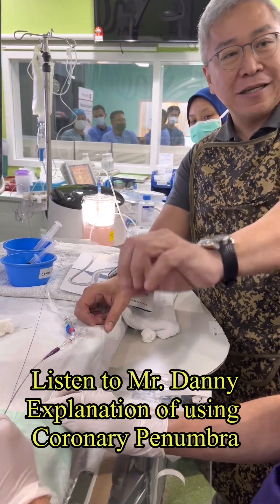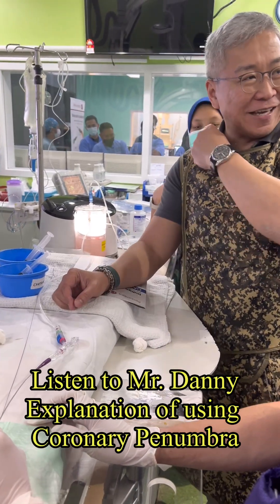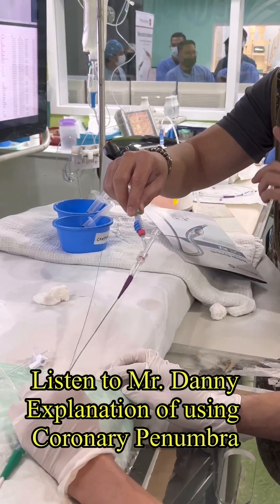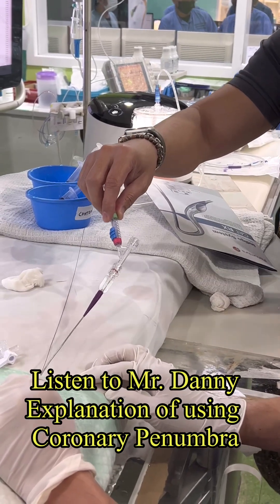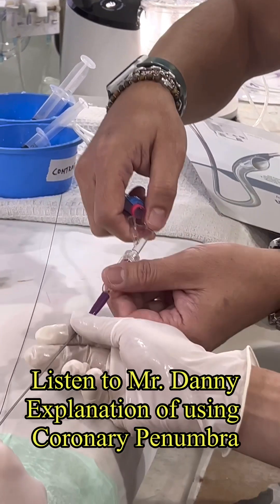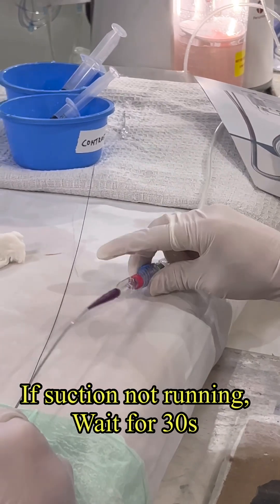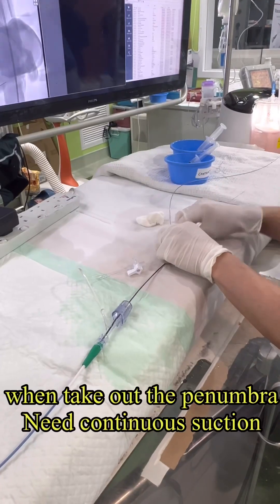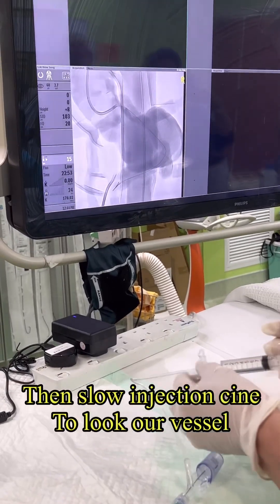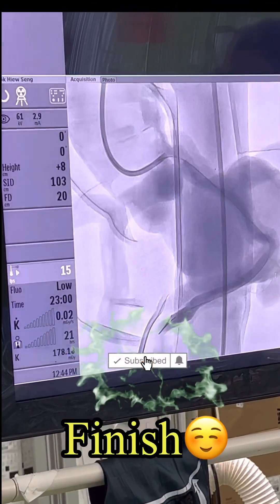The other thing is actually to clear the inner lumen. So you are separating, going in and out — it's the same function. I want to point out that if you use a separate Y connector, for this CATRX I would say 98% don't need a separator. So you just do a direct connection.